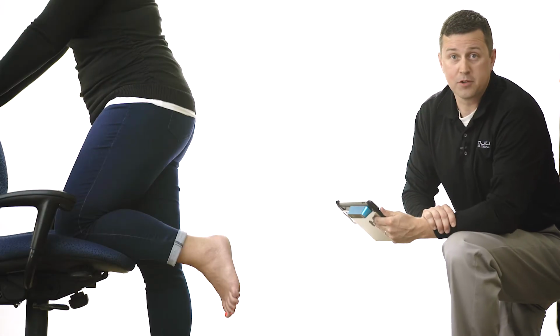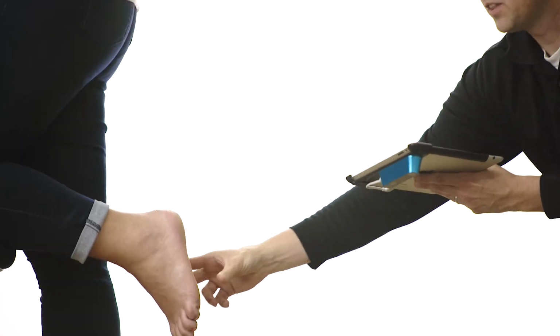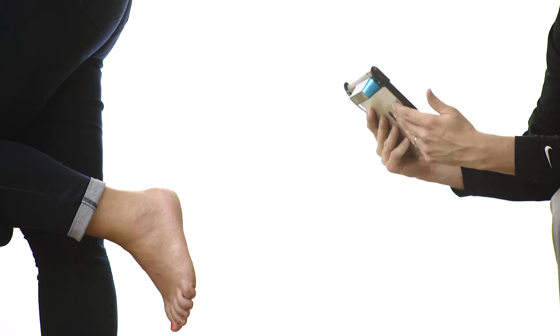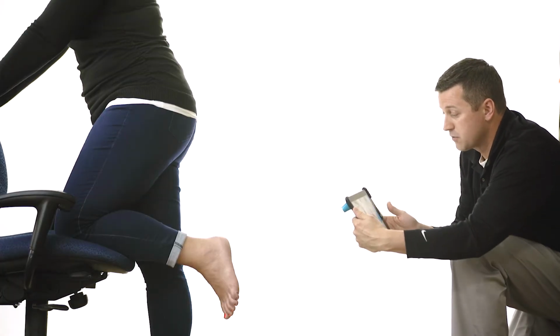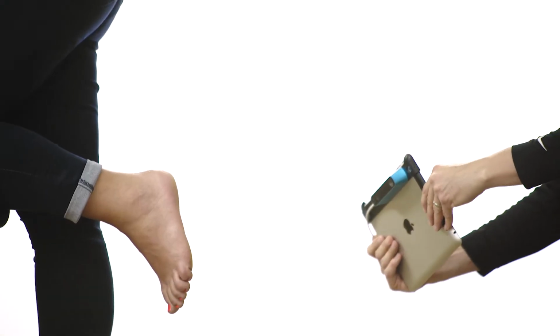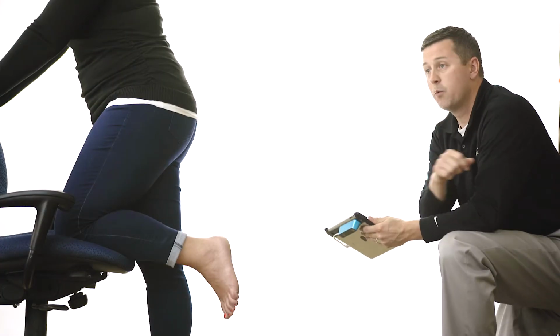Another method to capture the patient's foot would be standing with one knee on the chair. Get the patient's foot in as much of a neutral position as possible, then you can scan. I select scan, and again, I will keep the patient's foot inside that 3-dimensional box and rotate it around. Once complete, select stop, and we'll go on to the next foot.